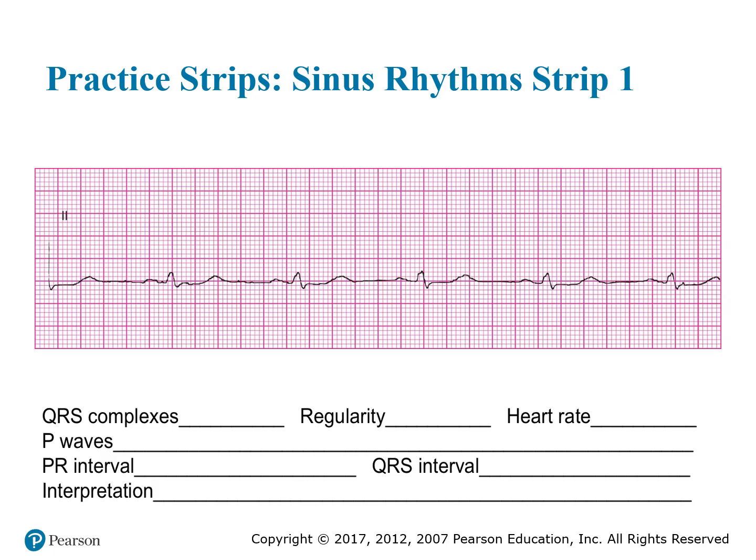A little bit of a cheat on this. It will be a sinus type rhythm, right? Because these are sinus rhythms, so everything's going to be a sinus something. So it's going to be a normal sinus, sinus tach, sinus brady with a PVC, sinus brady with an ectopic beat, something like that, right? So what do you see? If it's a normal rhythm, tell me that. If you see something ectopic, then tell me what you've got there.